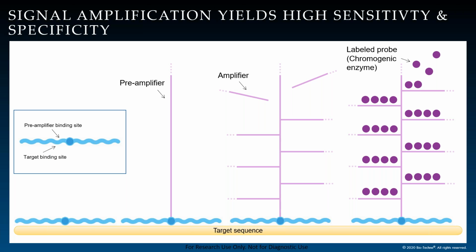As I just mentioned, one of the key features of the miRNAscope assay is the probe design. The oligonucleotide target-specific probes are designed using an informatics algorithm that selects sequences to specifically bind to the target sequence and not cross-hybridize with any other sequences. The bottom of the probe design complements and hybridizes to the target transcript, whereas the top of the probe is the base for the amplification structure, upon which a preamplifier can bind and the amplification tree can then be built.